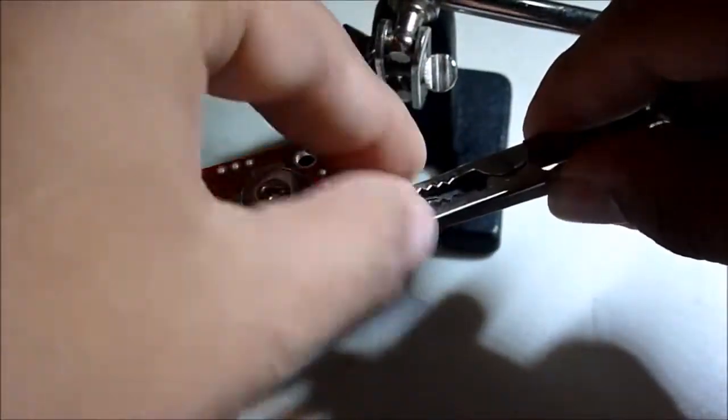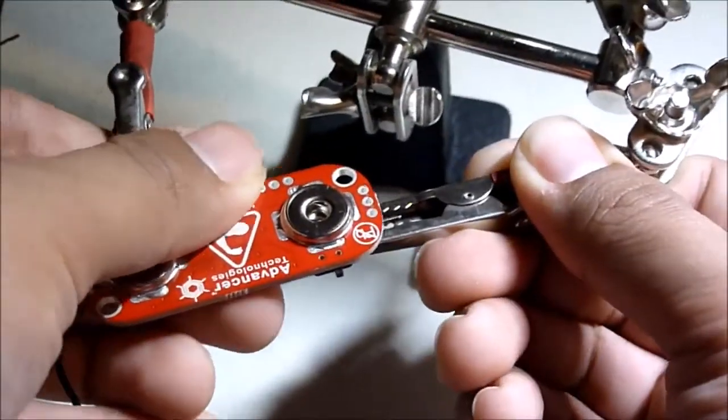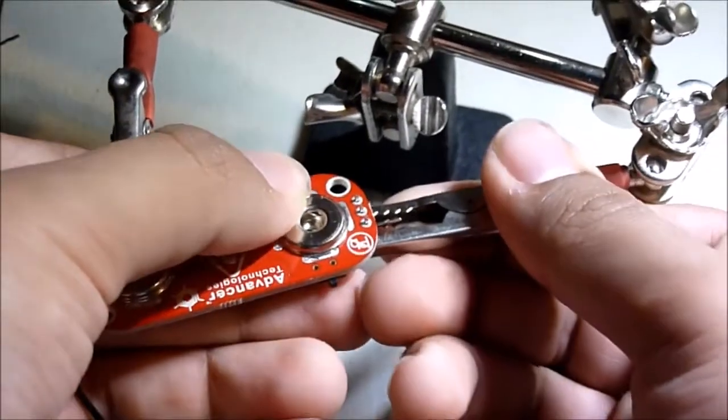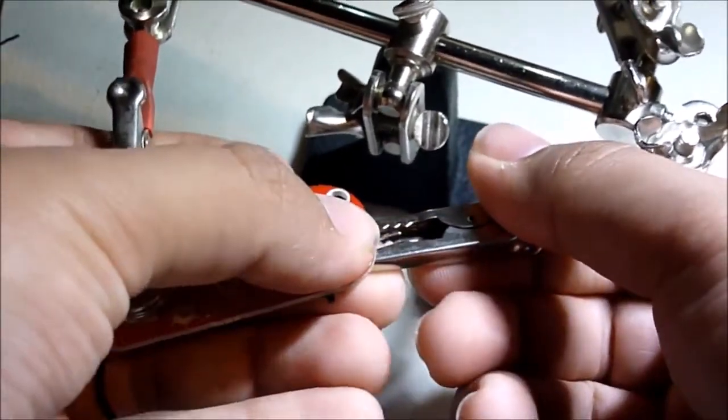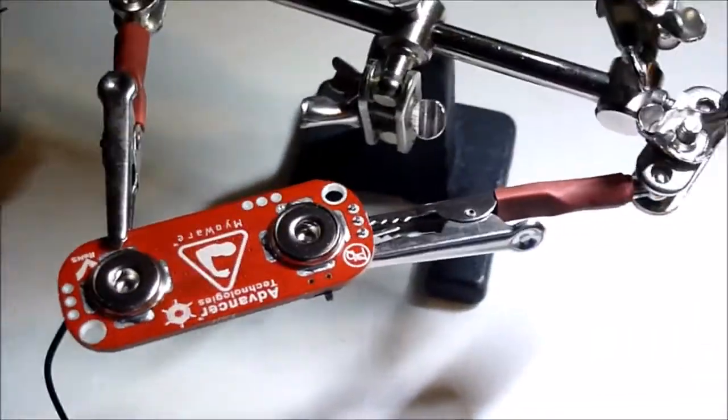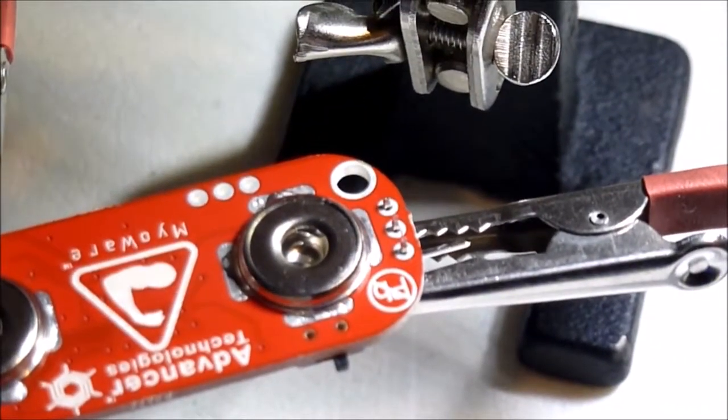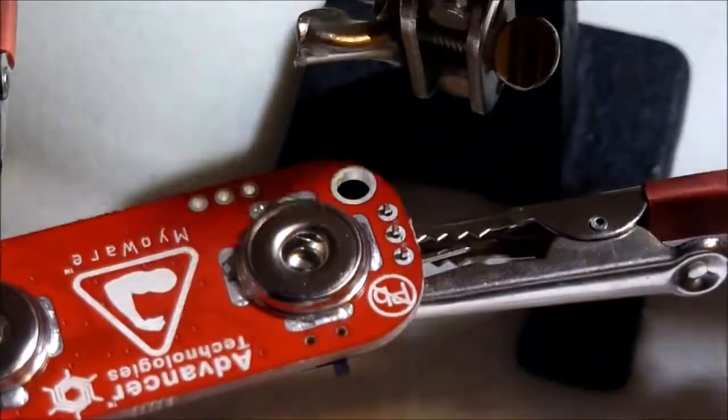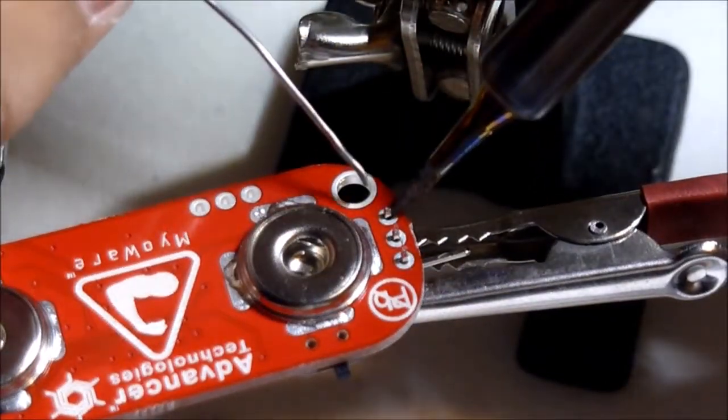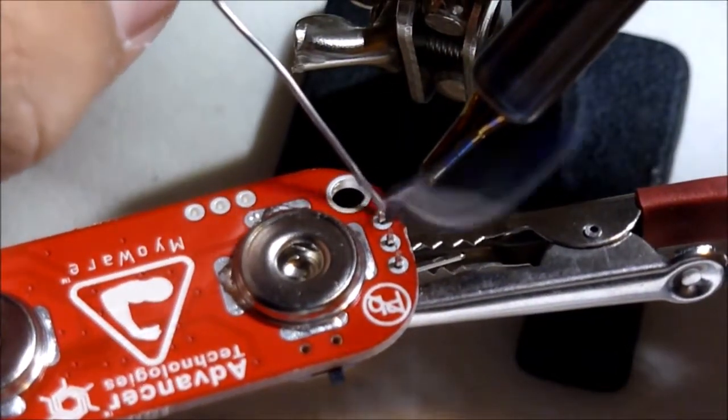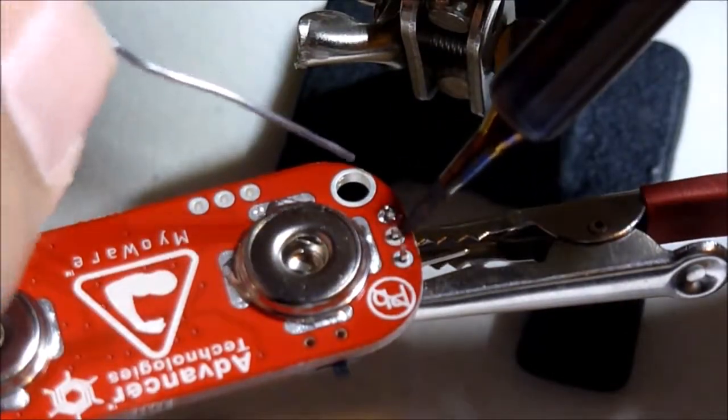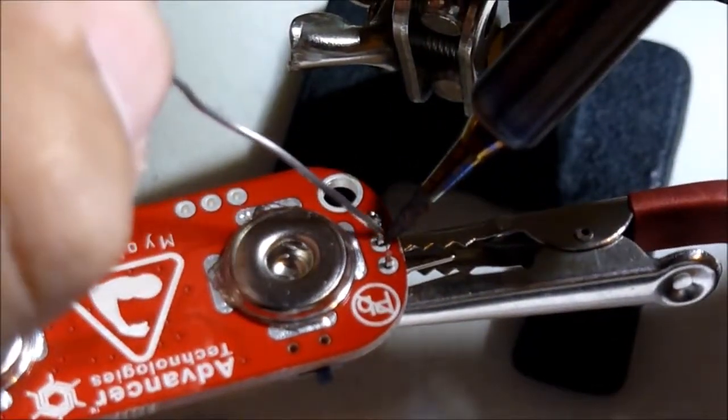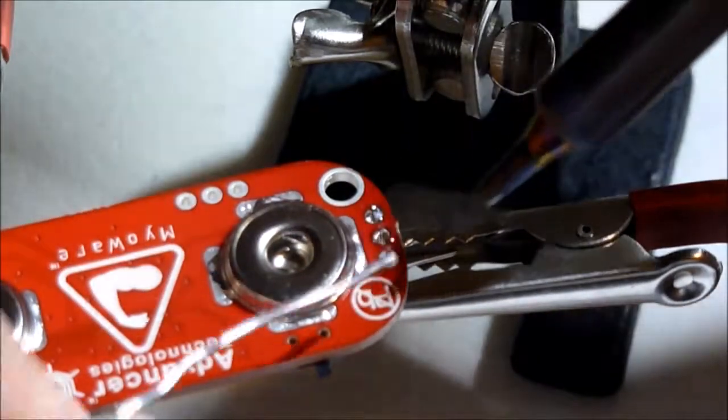Now I'm going to solder the header pins onto the Myoware sensor.